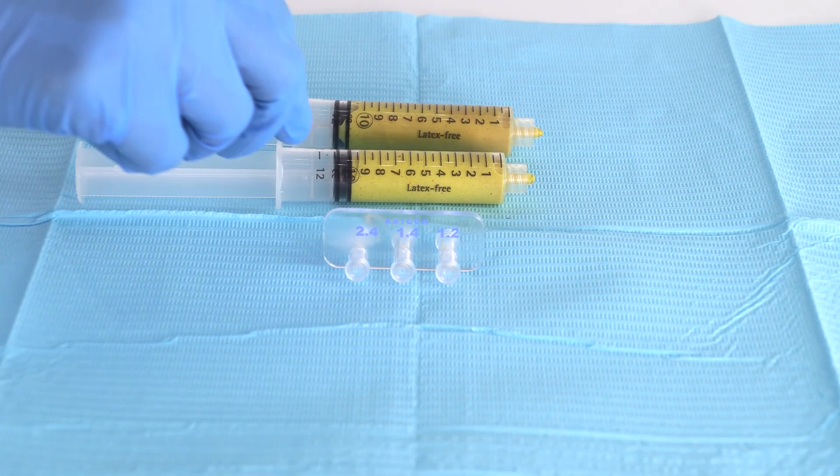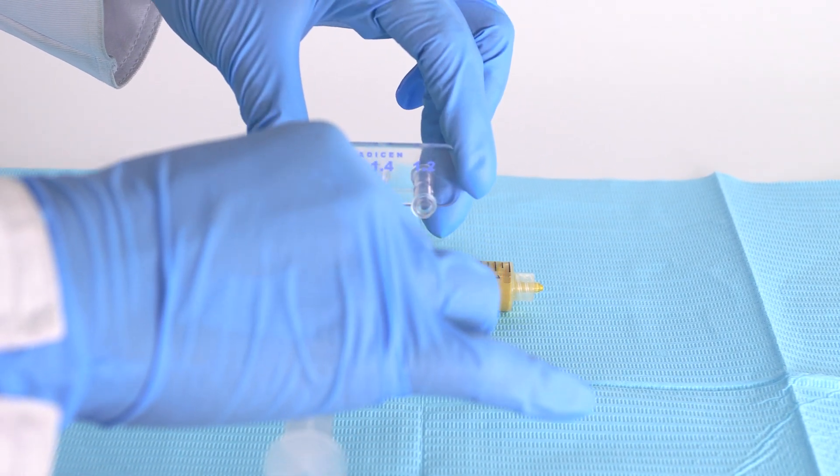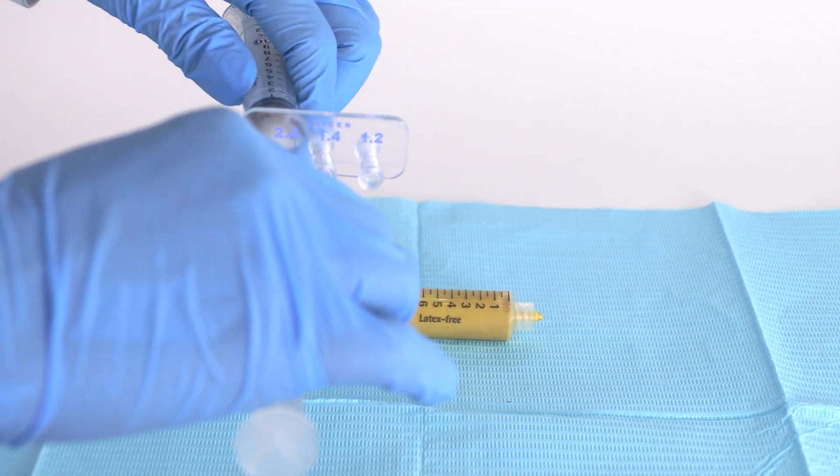If necessary, use the Adicen three-phase emulsifier to create a micronized cellular matrix of 1.2 millimeters.